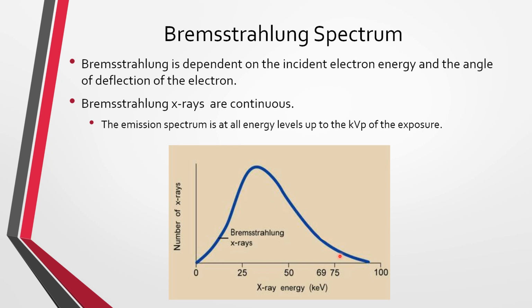The Bremsstrahlung peak is shifted to the left, and then it falls off as it goes higher, because only the most energetic electrons initially are going to be able to create these high energies. Then that electron is going to lose the energy and release the photon.